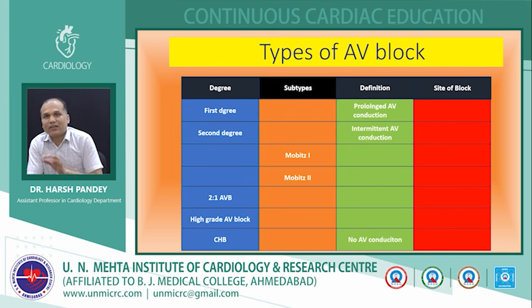I have not filled in the site of block here. We will go through all the situations one by one, and then we will discuss whether we can localize where the block lies in these particular kinds of AV block.